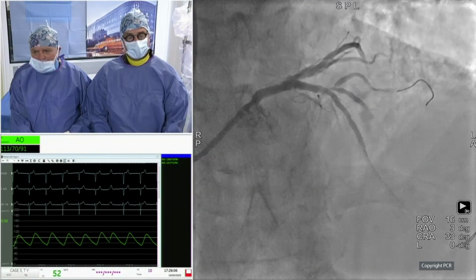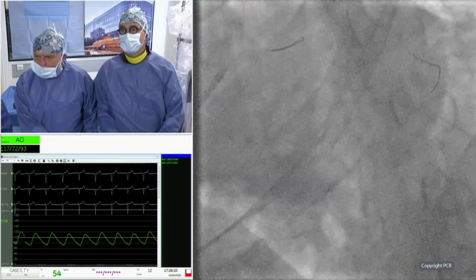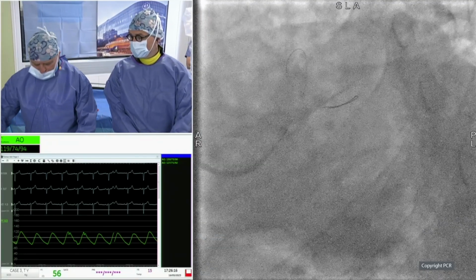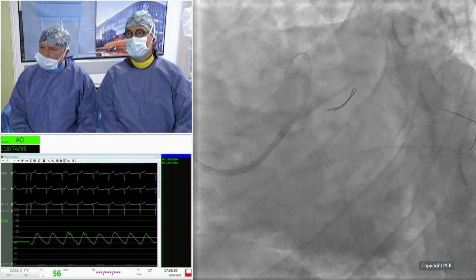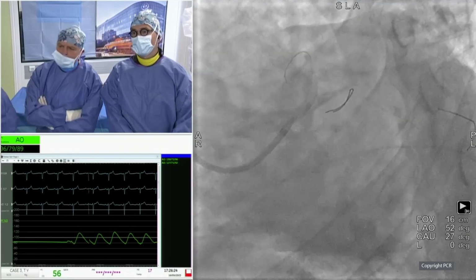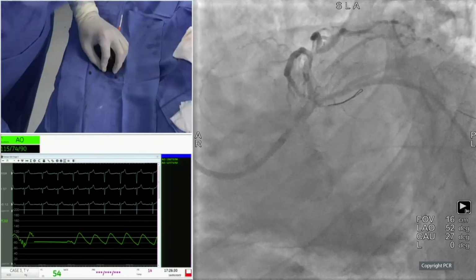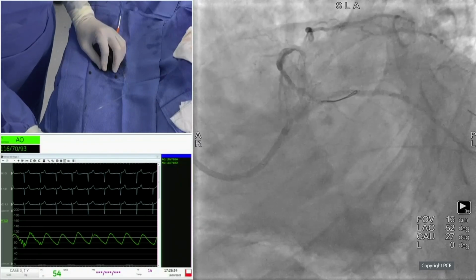Okay. So I found the information of Praveen really interesting, that before doing the pot you have this pressure wire there, and then if it's okay, you pull it out and then you do the pot. And you have heard that you can do lithotripsy along the pressure wire, that it will damage the sensor if the sensor is close to the shock wave, but not if it is far in the vessel.